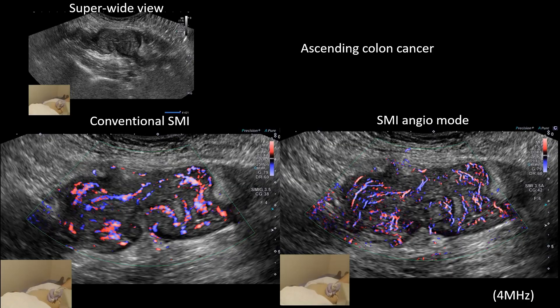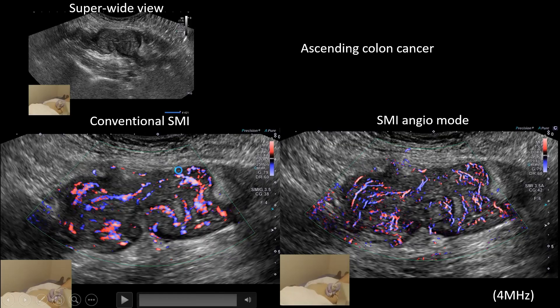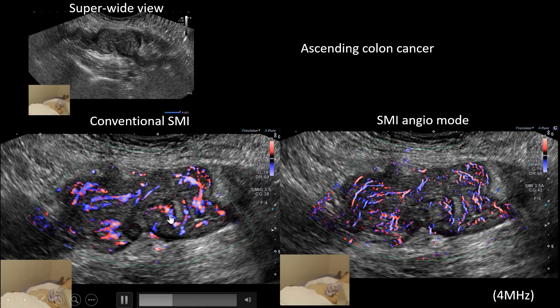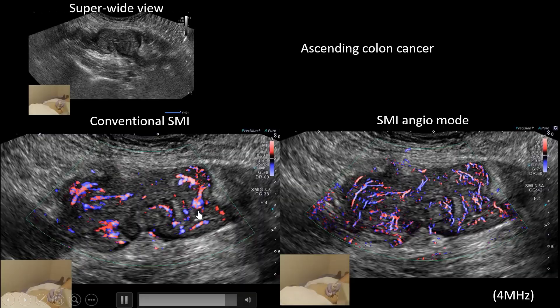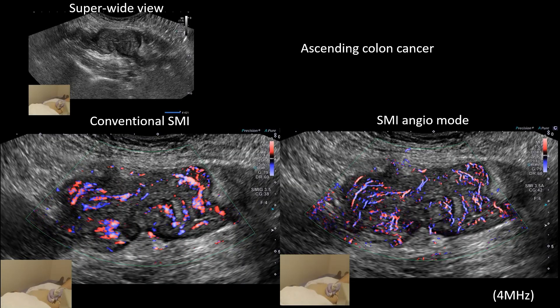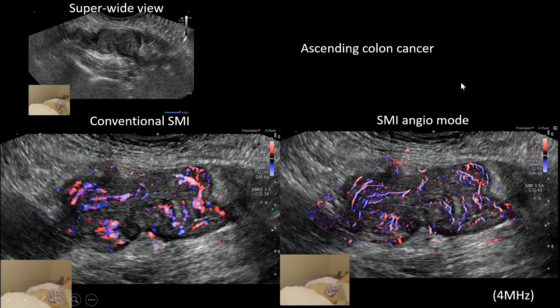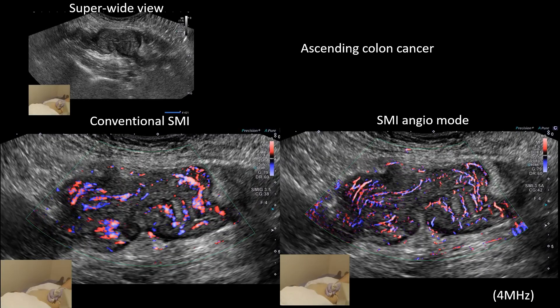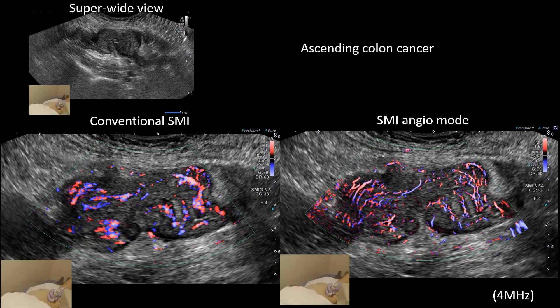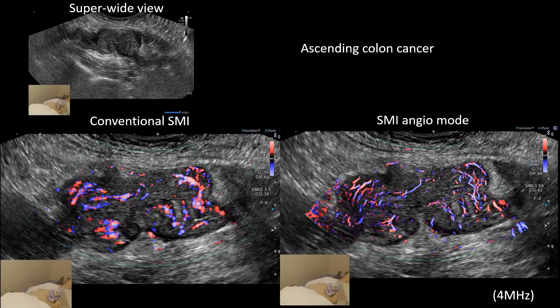This is a case of ascending colon cancer. You can also use Hi-Fi SMI with a super wide view. By conventional SMI you can see some vessels — not bad compared to color Doppler — but by using SMI Angio Mode you can delineate many more vessels really clearly.